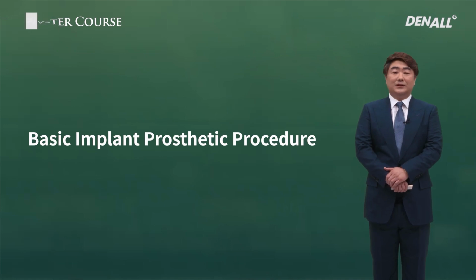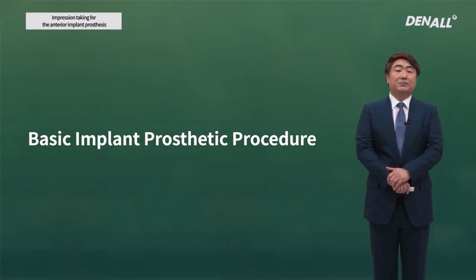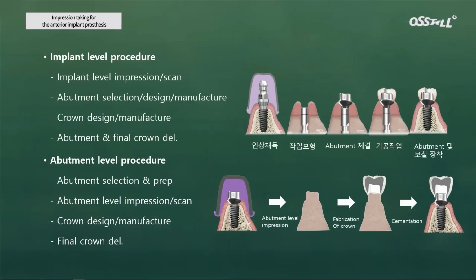So first, basically, how is the implant prosthetics made? First, after it's delivered, you take an impression. On the implant level, you take an impression, and also on the abutment level. And then after taking the impression, you manufacture things and then you deliver the finals.